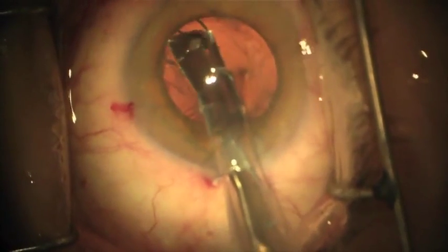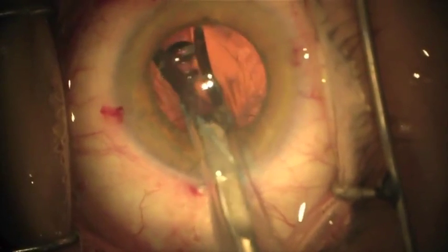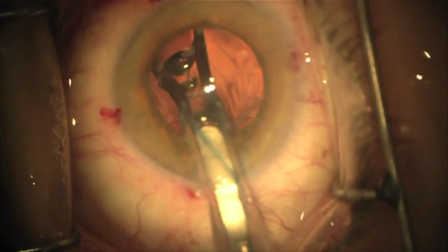As the optic comes out of the cartridge, you will begin to rotate the cartridge in a counter-clockwise fashion. The bevel should be facing down as the main part of the optic comes out of the cartridge. This will allow proper orientation of the lens optic.